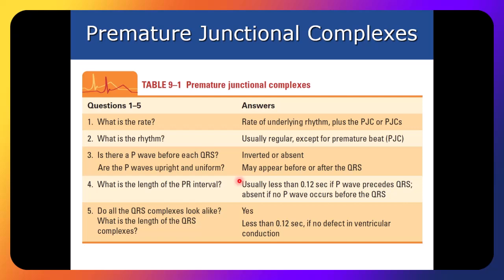Now let me ask you a question. If it's swallowed up in the QRS of a PJC, would that not make the QRS wider than 0.12 seconds? Why not? You're right. Tell me why you're right. I asked you first. Disrupt or elongate the conduction of that. It would not. Oh, well, there's a reason for it not to. What is the reason as to why, if that P wave is embedded in the T wave, that T wave is not going to be wider than normal?